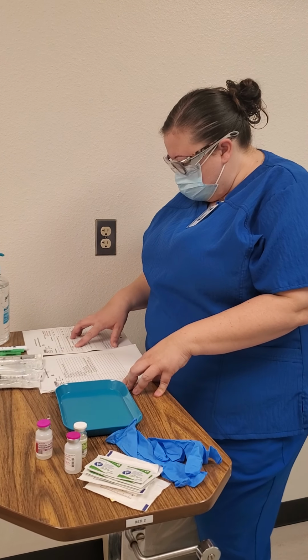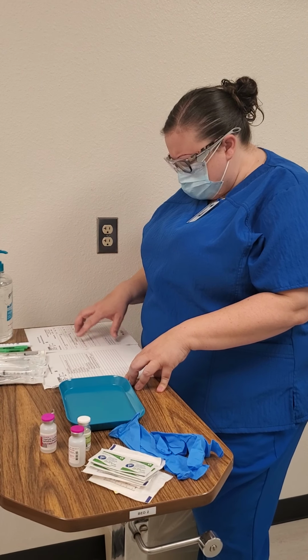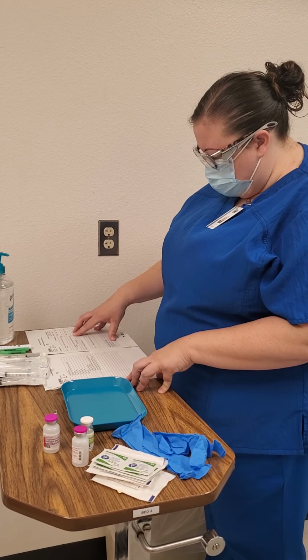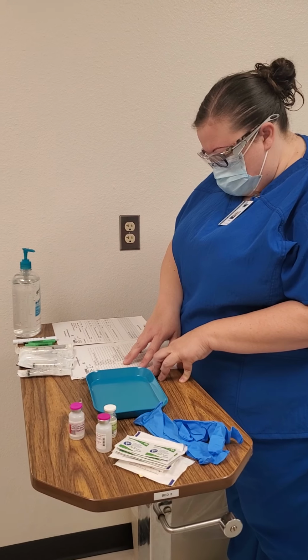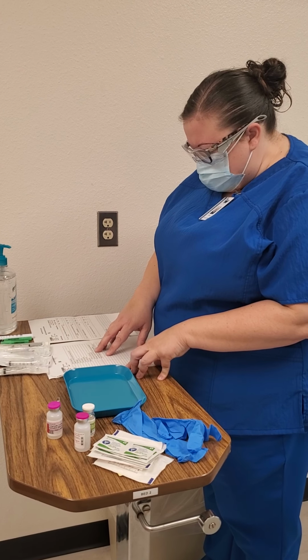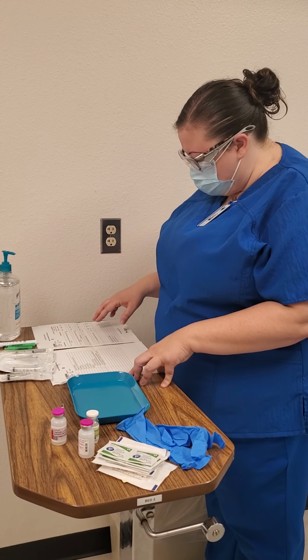The second one is going to be Phenergan, 25 milligrams intramuscular twice a day PRN, and this is a Z-track method, and that's going to be given at 10 a.m., and it's close to 10 a.m. here right now. On the doctor's order, it says Phenergan 25 milligrams intramuscular twice a day PRN. It's a deep intramuscular, and it says please preferably Z-track method if administering this medication.